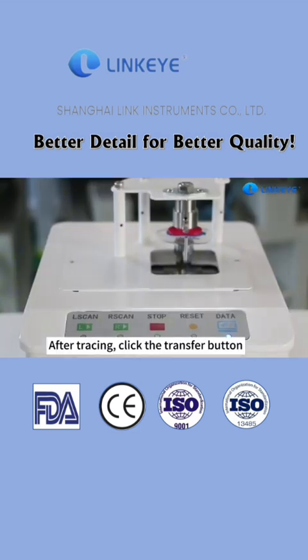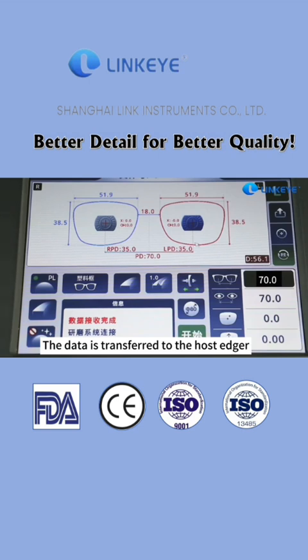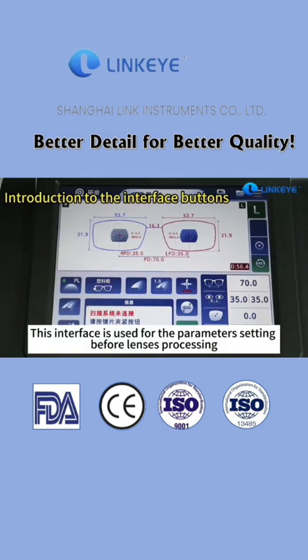After tracing, click the Transfer button. The data is transferred to the host edger, calibrating the program, adjusting the parameters. This interface is used for the parameter setting before lens processing.